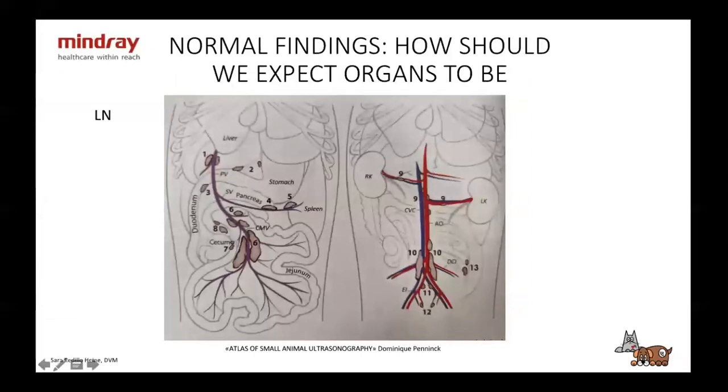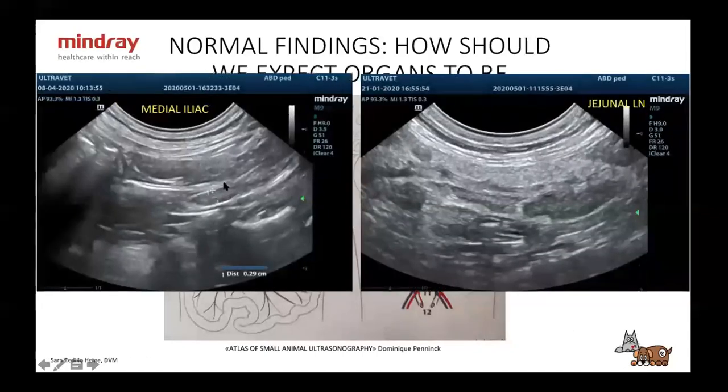I won't go over all the lymph nodes in the abdomen, but the main ones you'll always see are the medial iliac lymph nodes — located at the aortic bifurcation — and either the jejunal or mesenteric lymph nodes, which are the same thing.